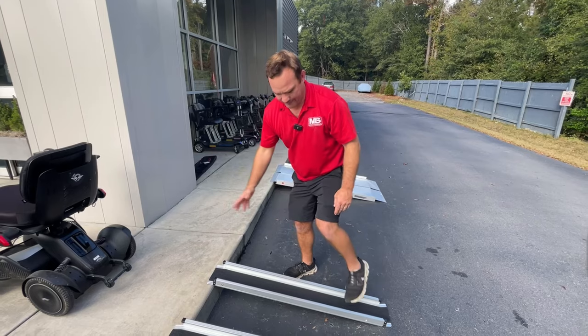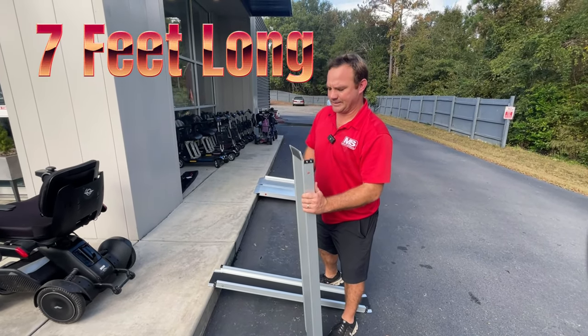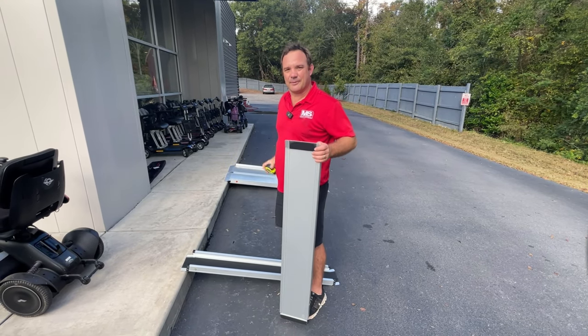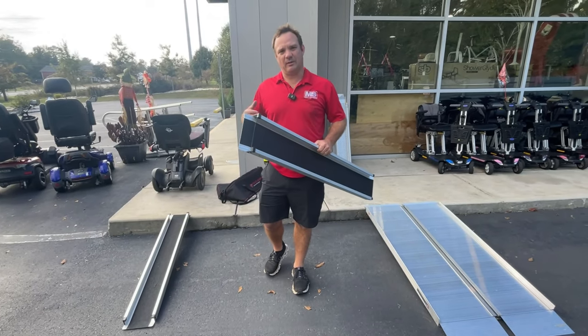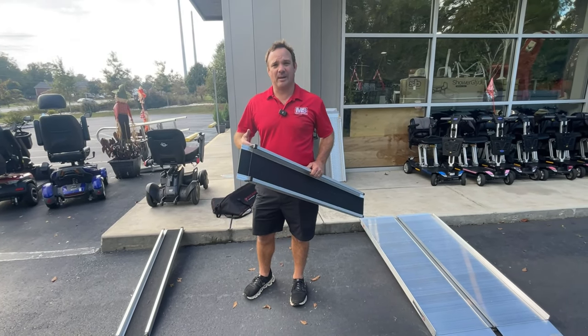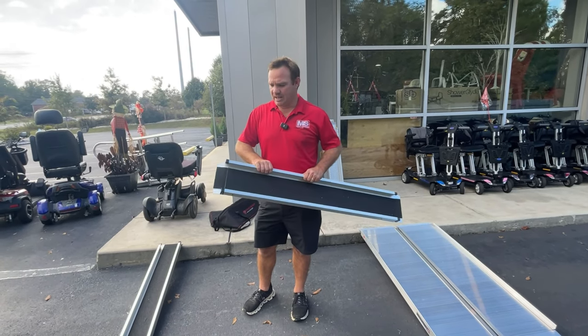You can put it like that for shorter distances, but it extends out to seven feet. Currently we are at four feet, and it expands out to seven feet. You can put this in a bag and travel with it. You can use these ramps for a lot of different situations — traveling, going to someone's house, or even loading something into the back of your vehicle. It works for a lot of different units, maybe not all.